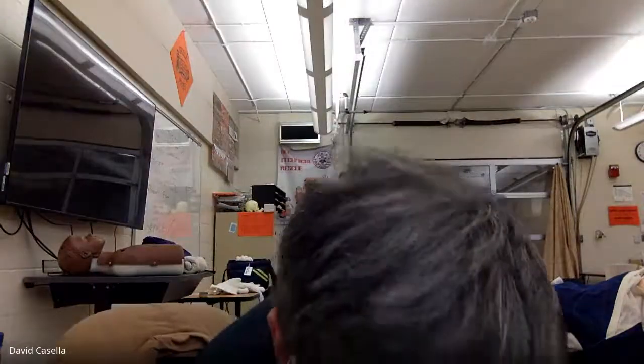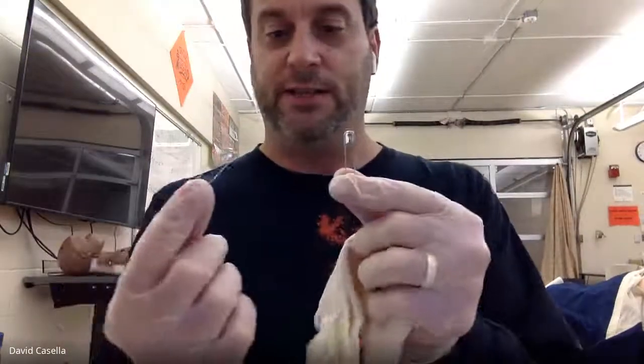The next thing I'd like to talk about is a cravat. A cravat is a triangular bandage. This is an example of one that you can buy that's disposable — some of you have this in the take-home kit. It's meant to be a one-time used item, but we can do more than that. It has two safety pins. You use those safety pins if you don't know how to tie knots. I happen to be a Boy Scout, so I know some knots.